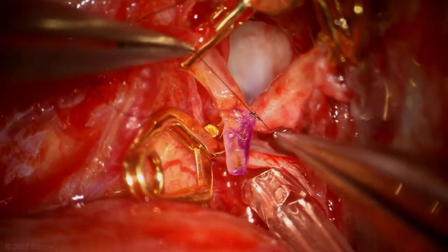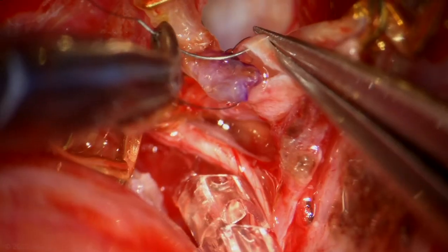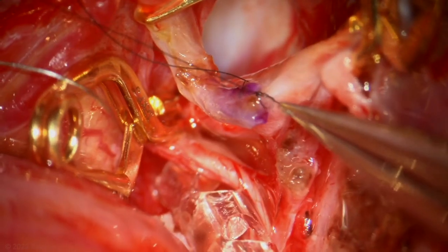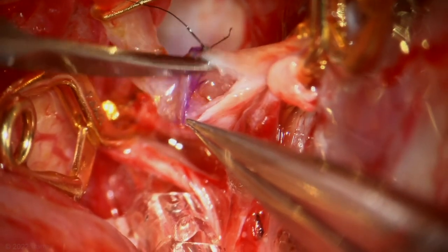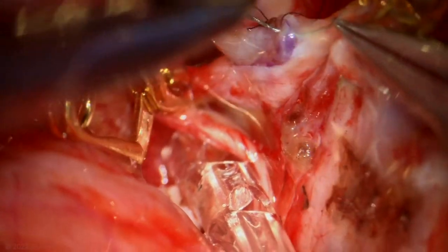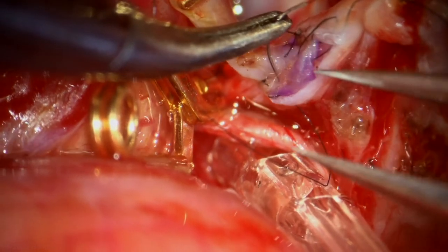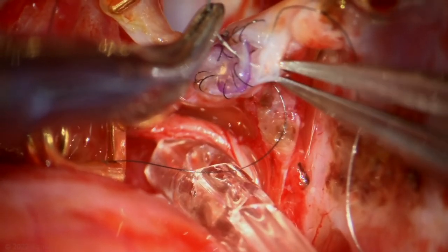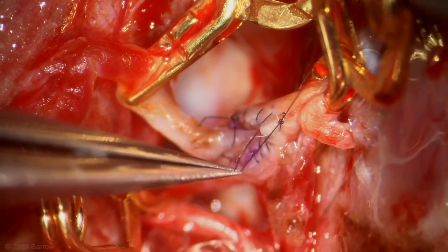I'm using 9-0 monofilament nylon, which has a healthy needle and a nice, strong suture thickness. I use running continuous suture technique to sew this back wall. The suture broke, so I needed to place an additional suture and also lengthen the arteriotomy, which widens the anastomotic area. I'm starting the second suture line by placing a second stitch, then running this suture line continuously, keeping the sutures loose until the end. This enabled better visualization of all layers of that vertebral artery wall. The loops of suture are then tightened and tied, and the anastomosis is opened.